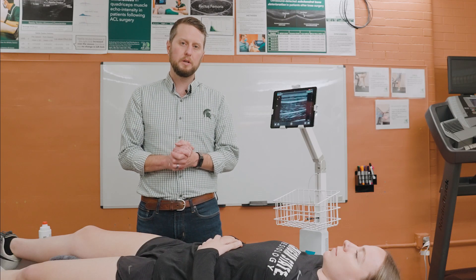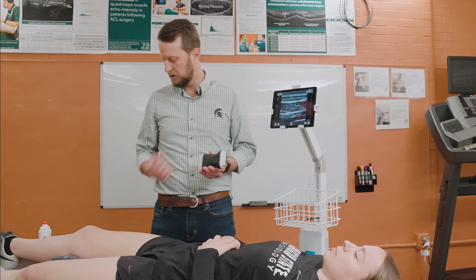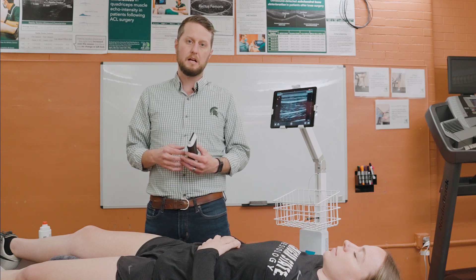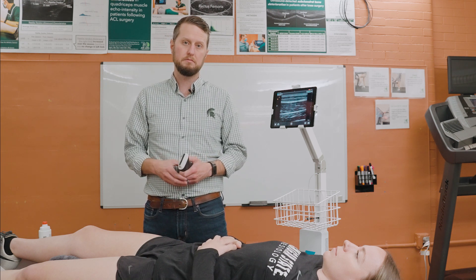Today we're going to be talking about a specific assessment using our Clarius ultrasound probe in conjunction with our USONO probe fix, to be able to dynamically assess how the muscle is responding to a physical activity motion.